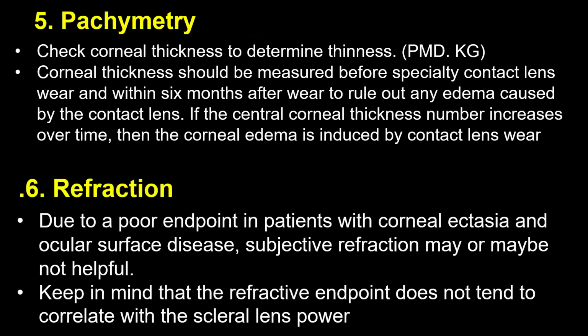So refraction, again, I need to mention, is not as important as the over-refraction. Why? Because the refraction may be distorted by corneal ectasia, which may distort the actual refraction you are going to have.